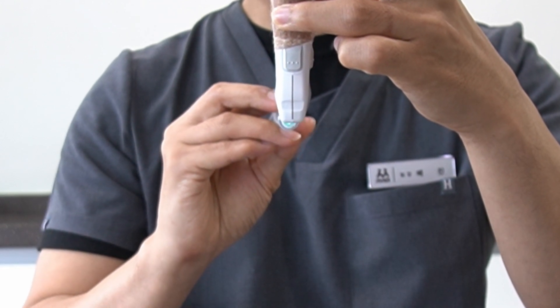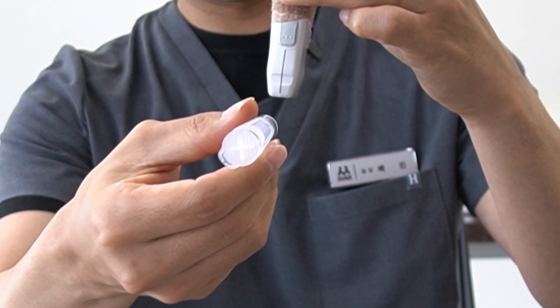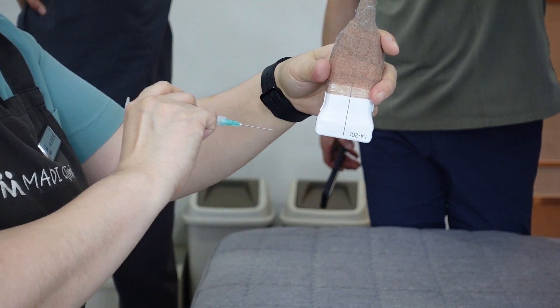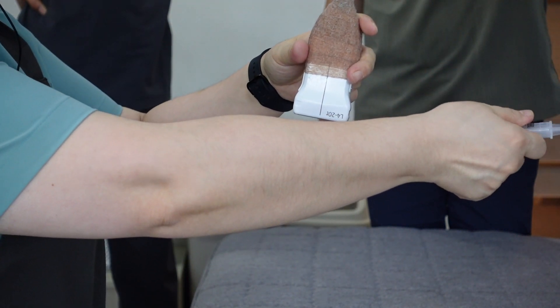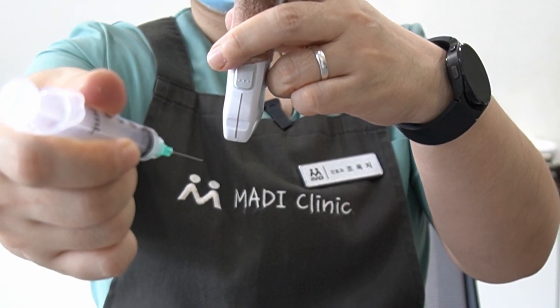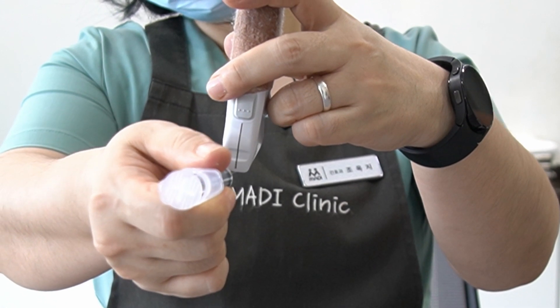It's as though an arrow is flying directly toward you. However, the needle is sent off its course as you can observe the instability of the moving right hand. Next, let's observe another participant's attempt. In this situation, the needle moves away from the operator towards the far side, and then comes back in from the far side towards the operator. Pay attention to the flawless, accurate needle movement when the needle moves away from the operator. In contrast, when the needle comes in from the far side towards the operator, you'll notice the operator's hands shaking and the needle straying off its central path.